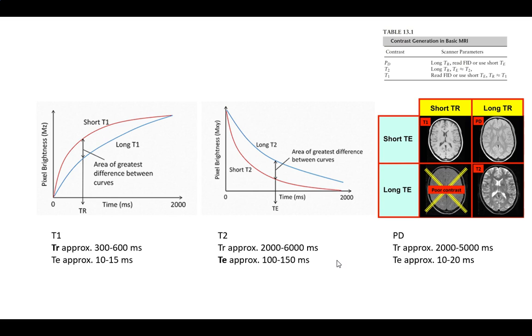There are much more complicated sequences out there, like I said, to really refine it. Yeah, sure. This is just going to be a practical question. For a given imaging system, if you're imaging one patient in one sitting, do you normally take scans of each type, each mode? No, it's going to depend on what the doctor wants.